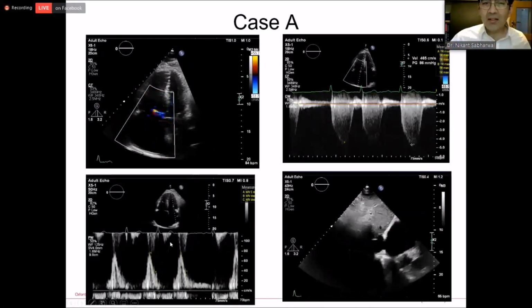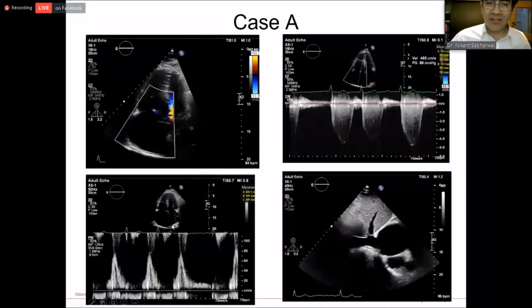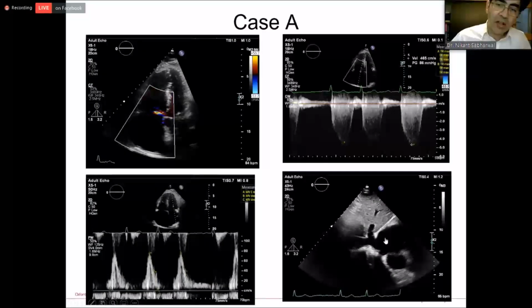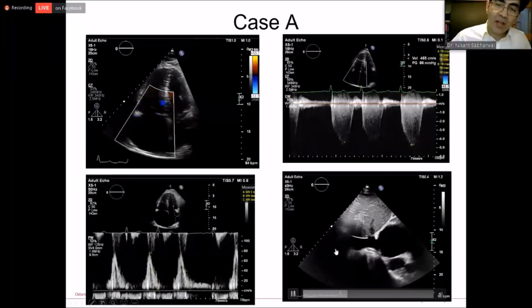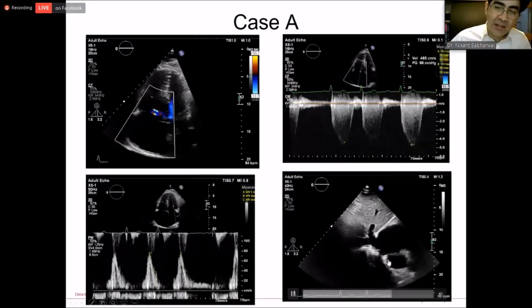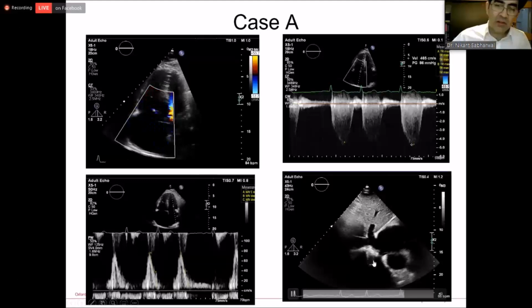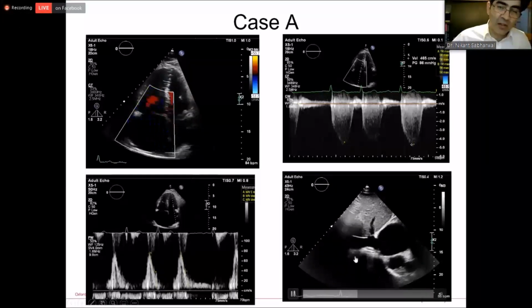So again, this now tells us, is there something going on in the left heart that's causing the right heart raised pulmonary pressure? And the final shot I've given you is the IVC. We can clearly see that's a big dilated IVC. The hepatic veins are very clear. I don't need to do the measurement. We all know that's going to be enlarged. And there's a less than 50% reduction when the patient's taken a sniff.